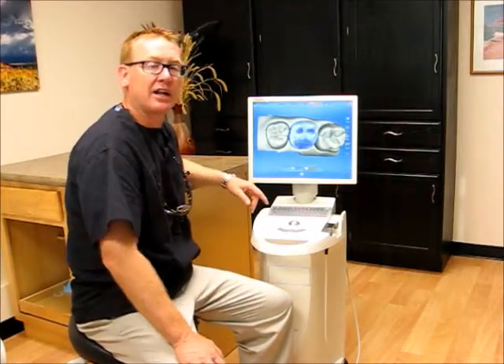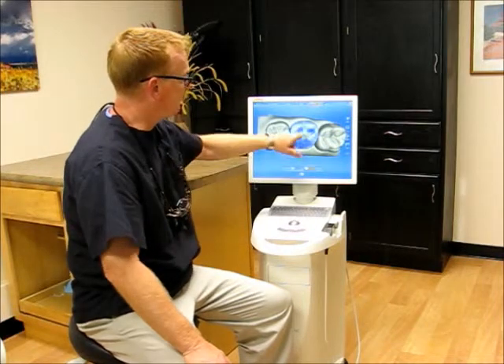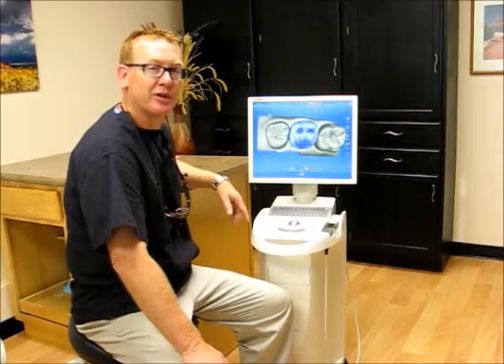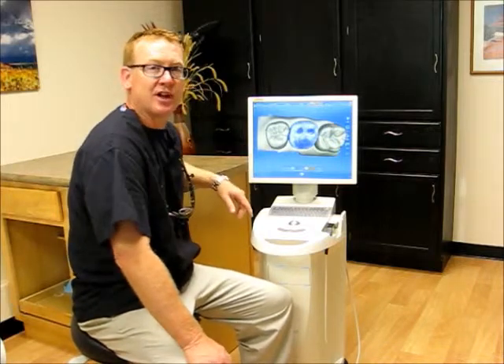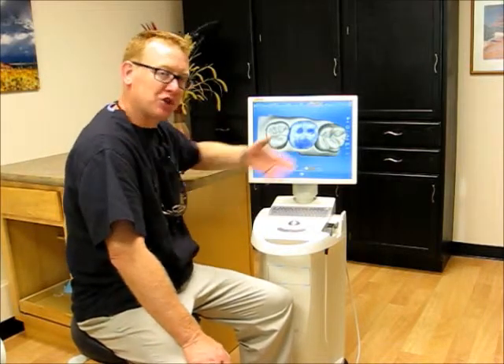You go to the design, and the computer actually designs the crown right for us, right here. It even shows where your bite is in blue, so we know exactly how your bite's going to come together. Once this is done, all we need to do is mill it out. I'll show you how we do that.